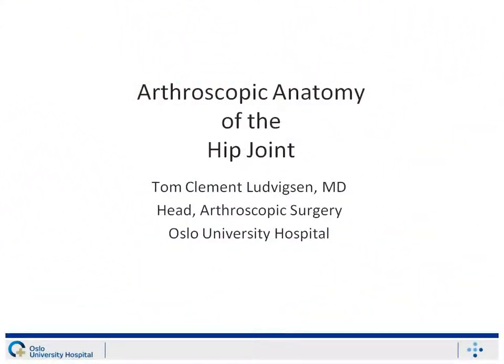I will talk about the arthroscopic anatomy of the hip joint.